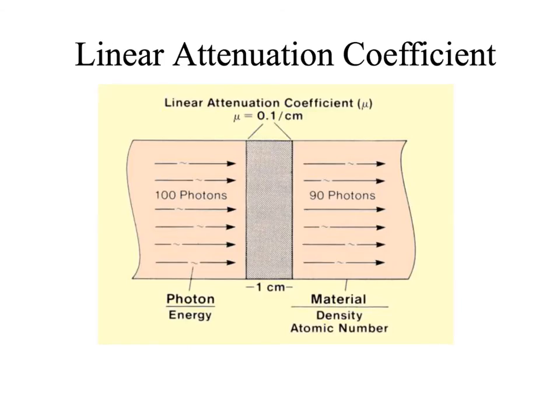Different way to think about it. The way that we measure linear attenuation is even more exciting than this lecture. What we do is we apply amounts of aluminum to the primary beam, and then we measure how many photons are there after they pass through the aluminum. And so we've linked now the linear attenuation coefficient of different tissue to the linear attenuation coefficients of different amounts of aluminum, right? And that's largely how we measure beam attenuation.